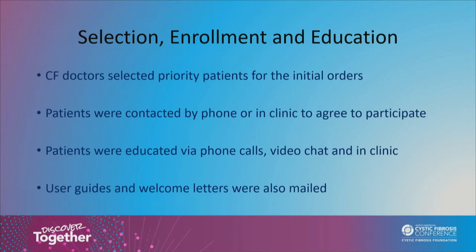So we kept track of the delivery of the spirometers by tracking numbers. When we knew that the spirometers had been delivered, we reached out to the patients again, and we provided education via phone calls primarily. We did educate a limited number of patients in clinic. Some of them we did by Zoom, FaceTime.